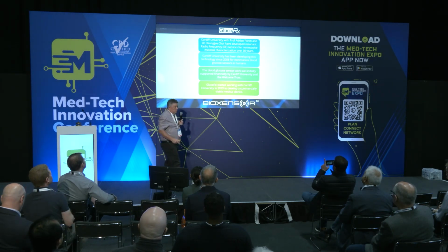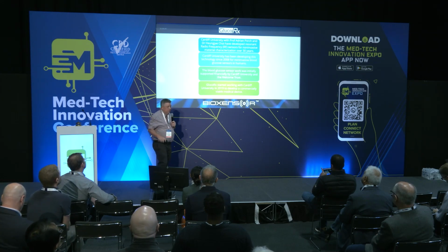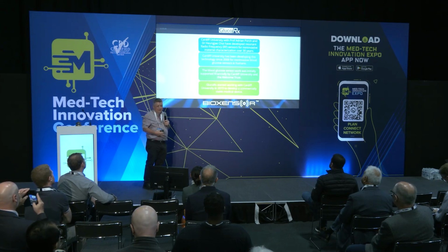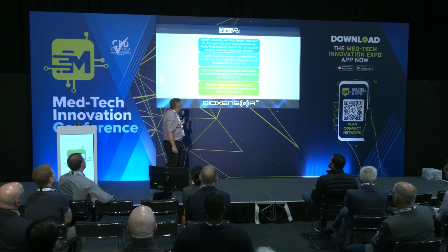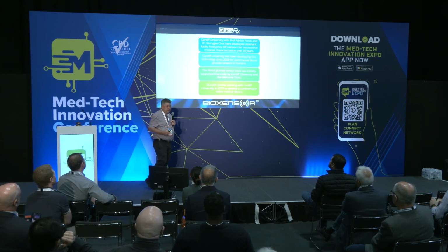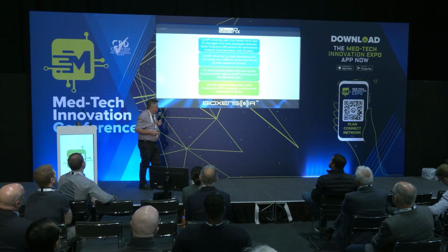Basically, I've been working with this sort of stuff for all my research career now, which is 30-odd years. I put things in high-frequency fields and then see how they respond. So obviously, the thing we're talking about here is the body and blood specifically. Since 2008, at Cardiff, we've been developing non-invasive methods for studying blood glucose using electromagnetic means.